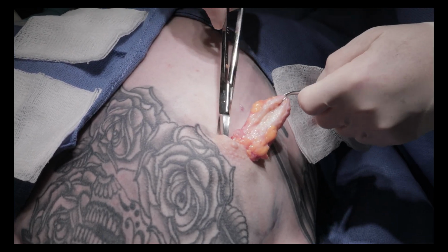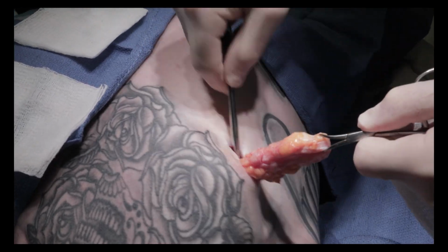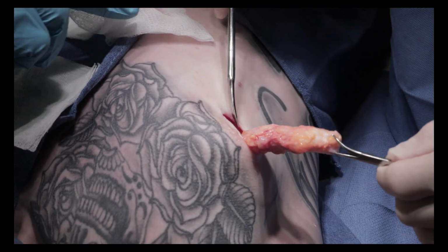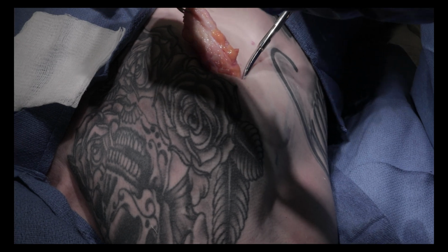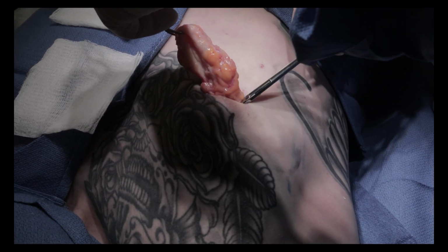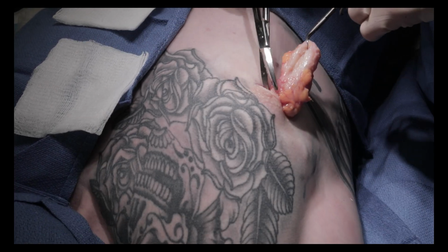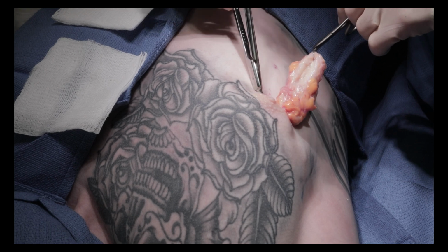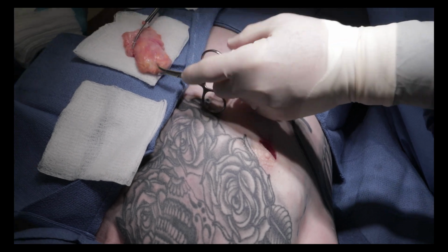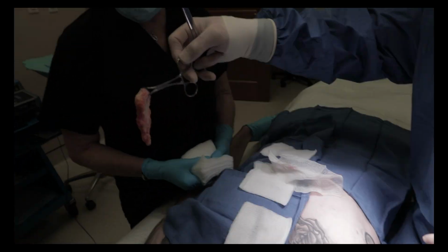I'm feeling the drain. Let's see, need a little more local. Alrighty, almost there. Almost evicted. There you go. Eviction completed. Nice. So that's your gland. Take one.